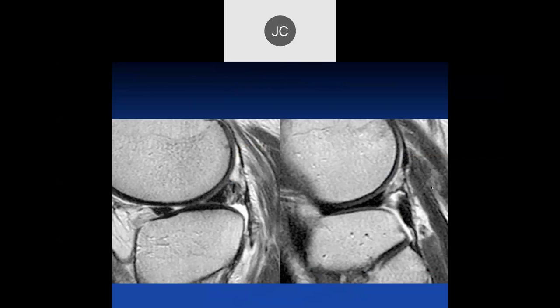So two more sagittals, lateral compartment. Looking at the posterior horn, there's increased signal posteriorly there. I'd be again concerned for another meniscocapsular injury. Here, this is probably the periphery of the meniscus, and here we're seeing a lot of abnormal morphology and thickening and indistinctness of the tissues in the region of the posterior struts.